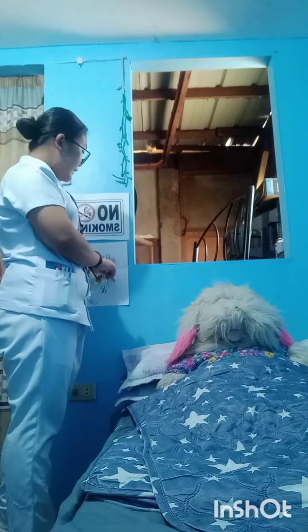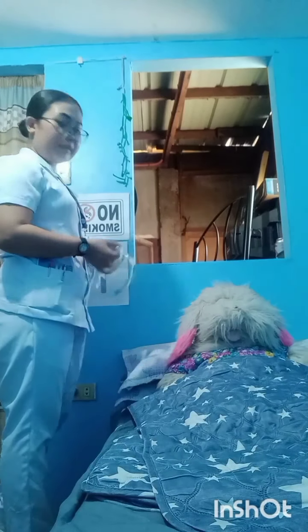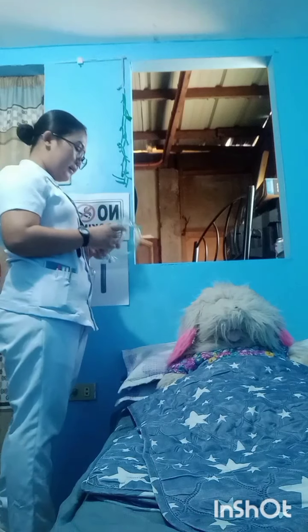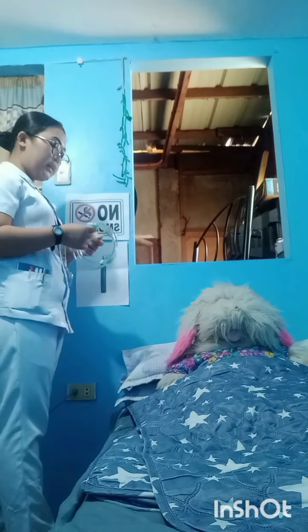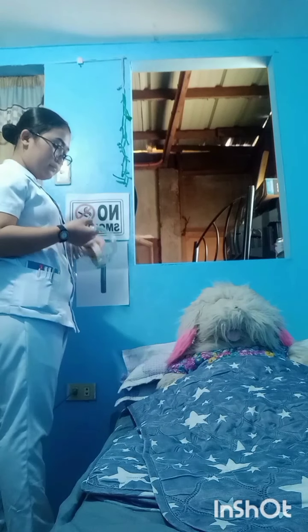So, assuming na iti-tape ko siya dito ang delivery device sa ating humidifier. So, assuming na ito yung ating oxygen tank, yung humidifier bottle. Ipipaste ko siya dito.